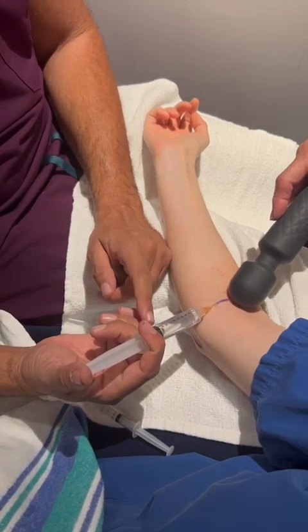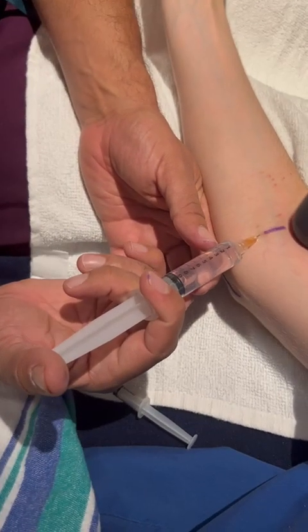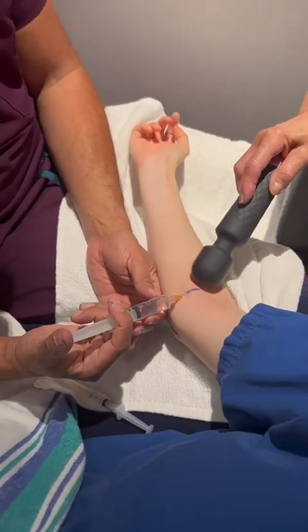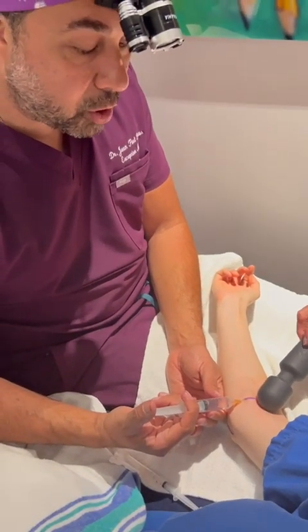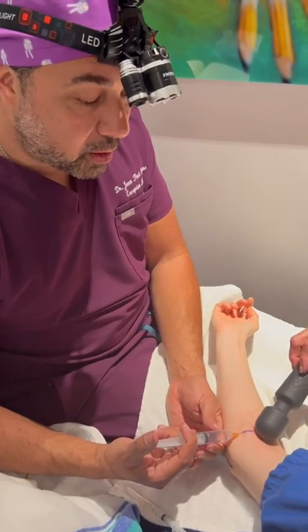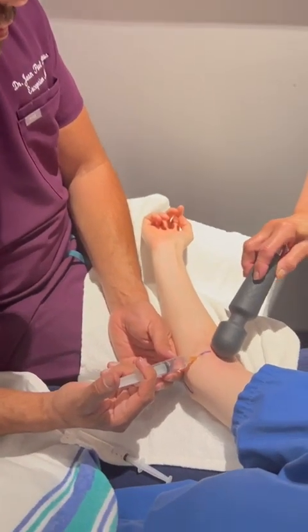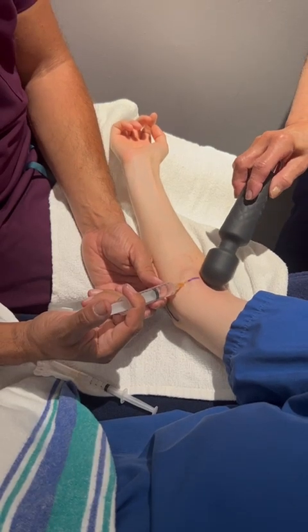The key is to again stabilize the syringe and the needle. The distraction continues — it's important that it's dynamic, so it moves around. And I inject slowly, so that there's not a lot of pressure building up under the skin, and then it doesn't hurt. Does it hurt you right now? No. Zero? No. Perfect. So all you felt was the initial poke, and then we're done.